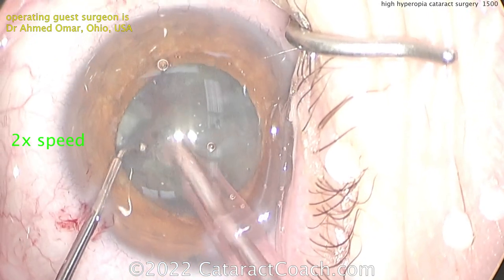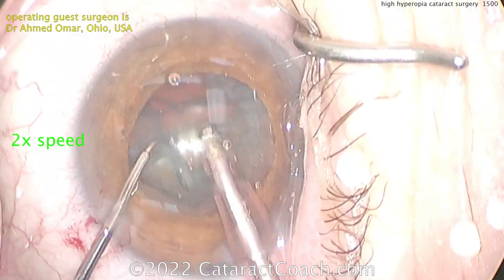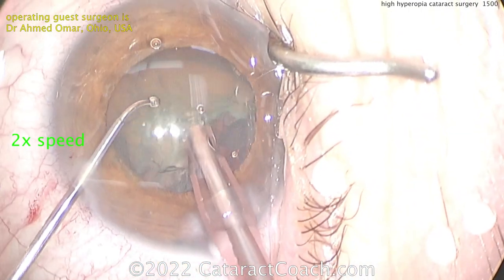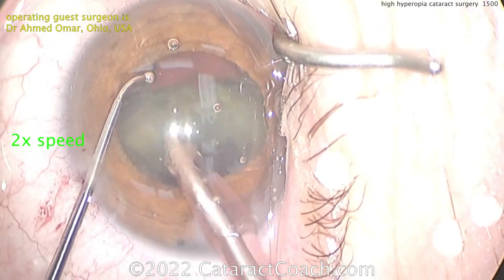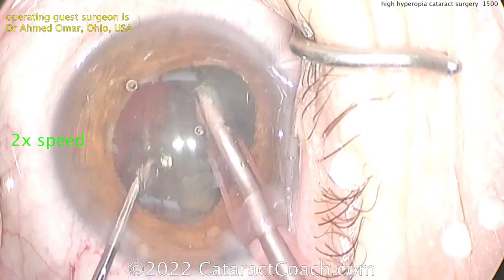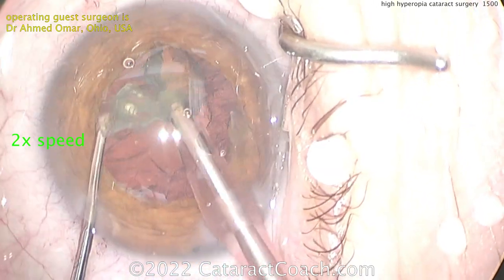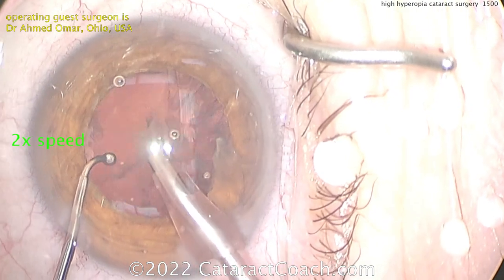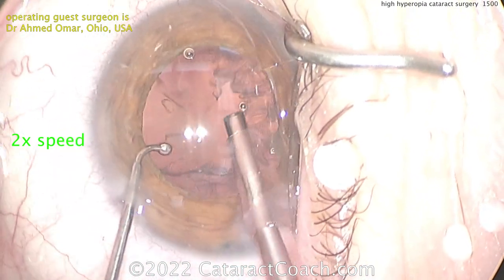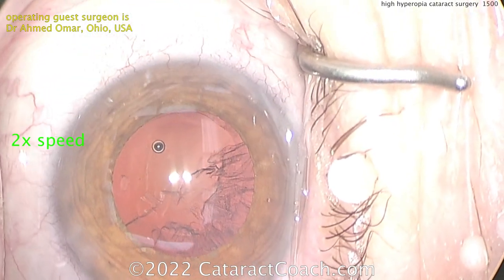Each half can be gently chopped, brought up to the phaco tip, and aspirated pretty easily. Notice it's not too dense of a cataract, which is good. I'm glad the patient didn't wait until it's a very dense rock — that makes life easier for both the patient and the surgeon. Here comes that second half. It's important to keep good fluidics in these eyes. In these nanophthalmic eyes, remember there's a higher risk of choroidal effusion or choroidal bleeding. You want to keep the anterior chamber pressurized the whole time and maintain a sufficiently good infusion pressure. Now it's time for cortex removal.